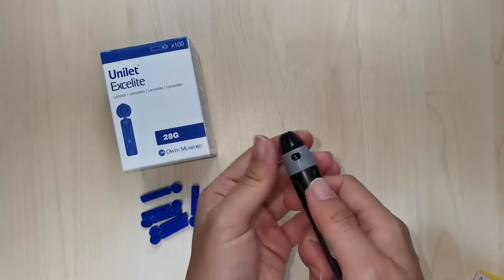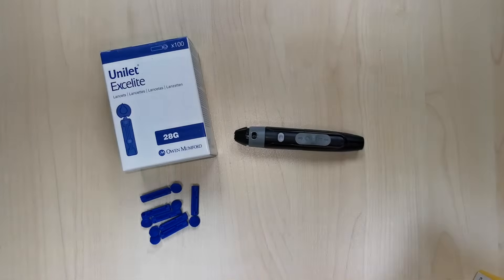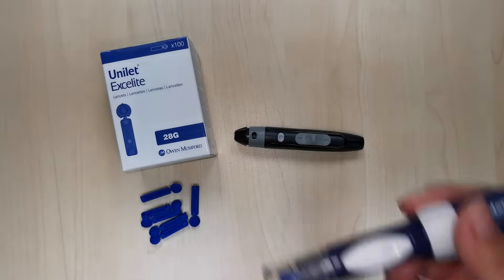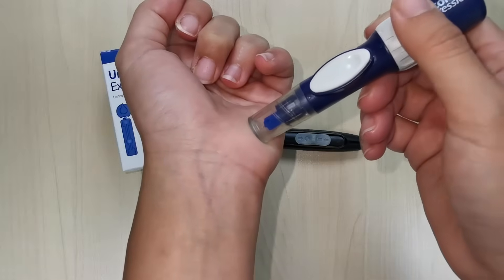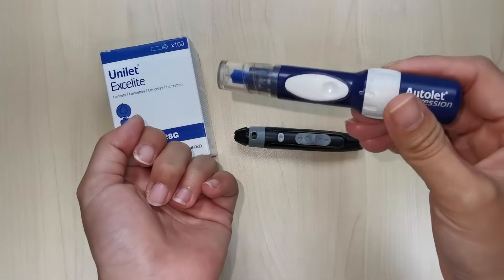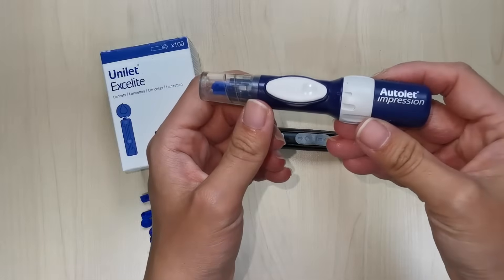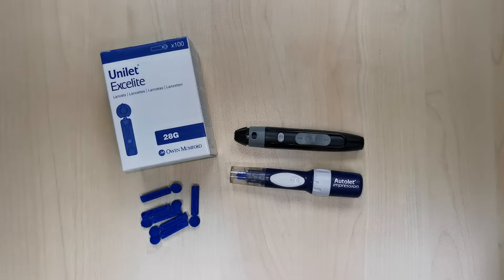For alternate site testing, choose a penetration site on a soft fleshy area of your arm or other recommended site, away from bone and free of visible veins, moles, bones, and tendons. Use the clear cap on the alternative site for testing. Always remember to refer to your blood glucose monitoring system for instructions on how to obtain a blood glucose reading.